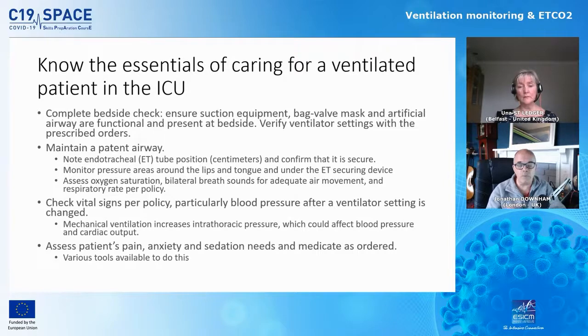As I said, it's not the balloon at the end of the tube that's keeping it in. It's the actual tapes going around the patient's face. There are various different devices these days for securing the tube, and you'll just need to get used to the one that your hospital uses. Making sure it's secure: if it's just tapes, you should be able to get a couple of fingers under, but no more. If it's any tighter than that, you can be risking pressure area problems. If it's any looser than that, then the tube can move in and out.